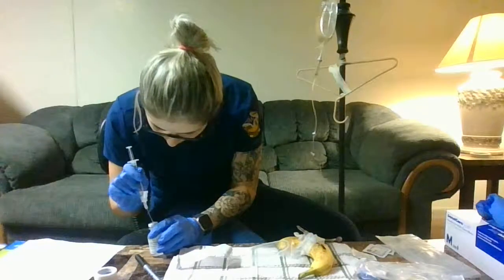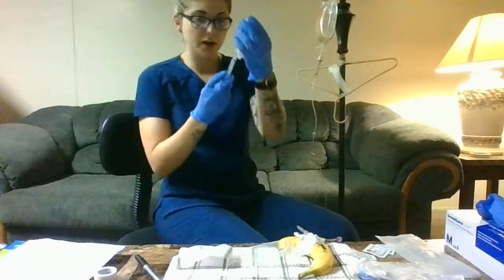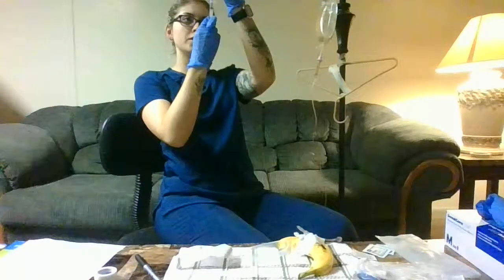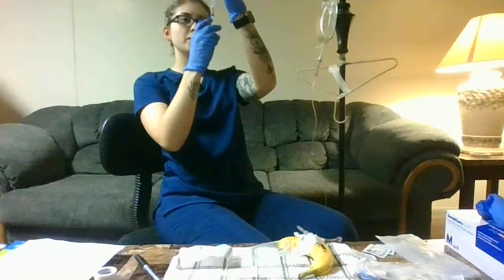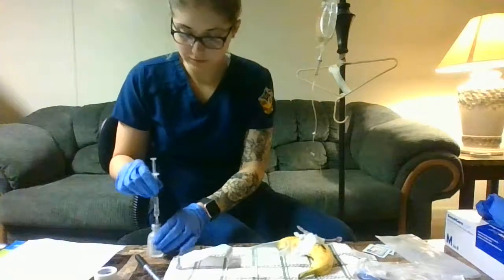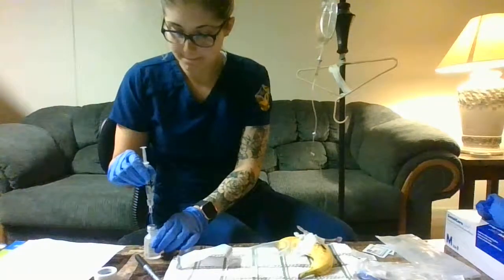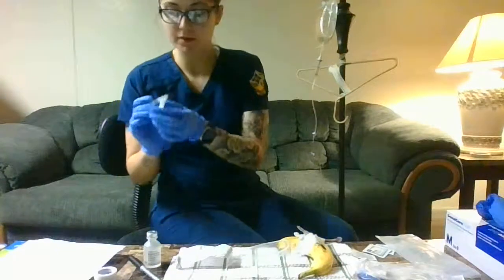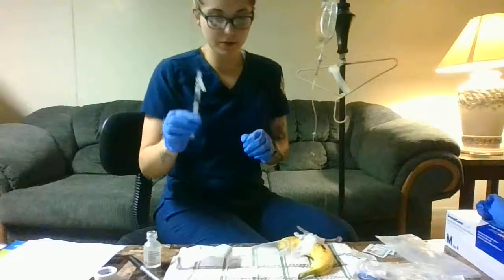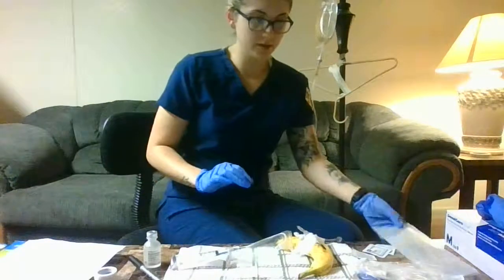Gonna pop that in, put the air in, invert it, and take out the 1.1 milliliters. Making sure don't have any bubbles in there. Okay. No bubbles, all good here. Have your medication here. I'm gonna set it right back down.